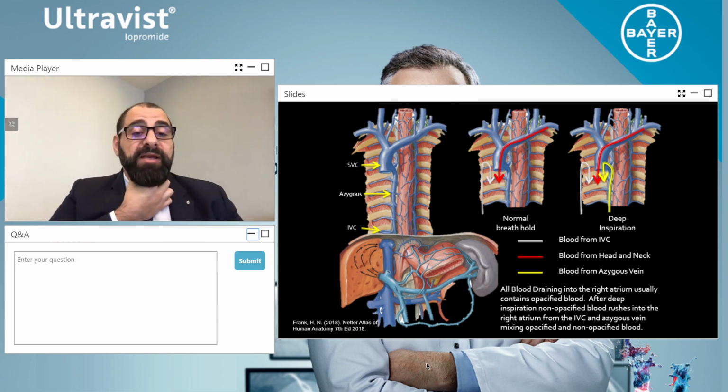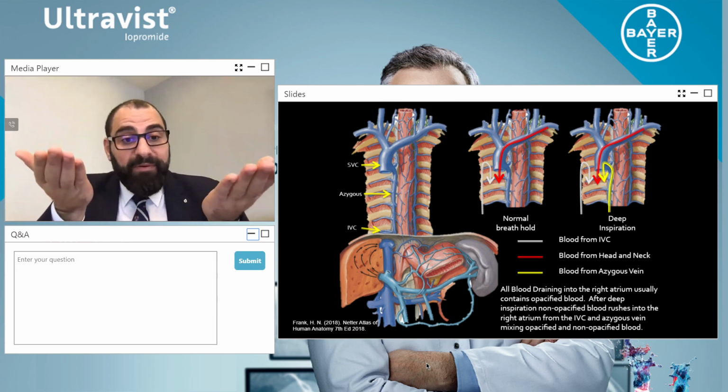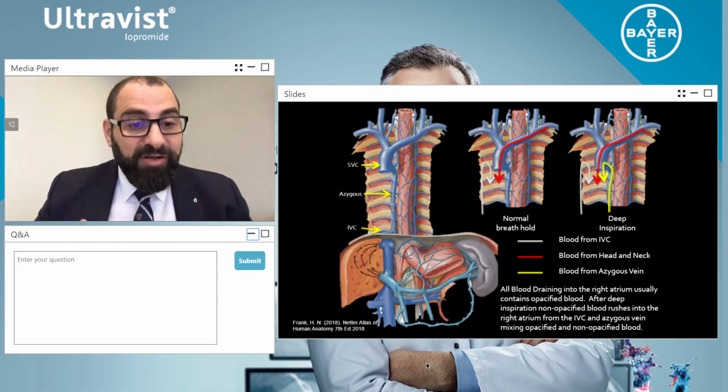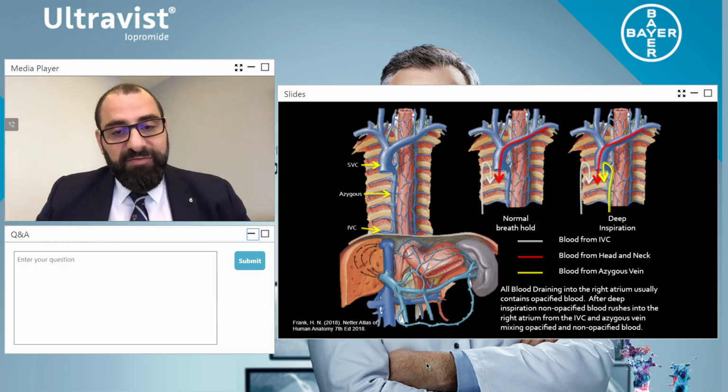So let's breathe in. Hold your breath. Don't breathe. Breathe away. So automatically, you would have felt that your heart rate and your blood pulse went up. This is what we do with our mouth closed, and this is what most of the patients are doing. So how do we solve this problem?